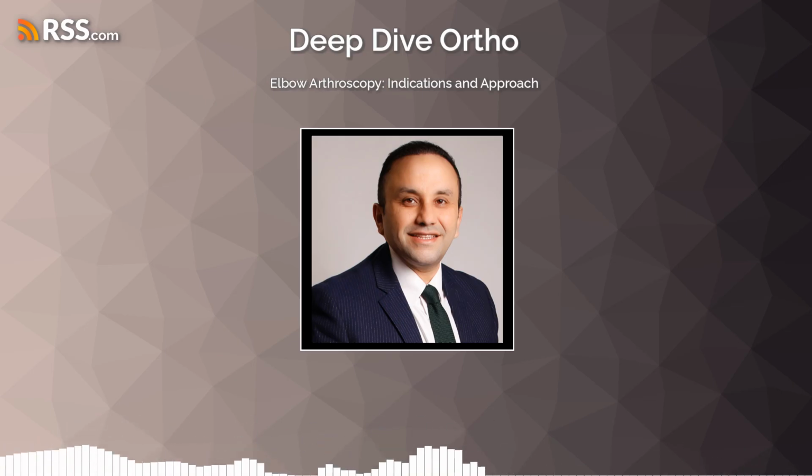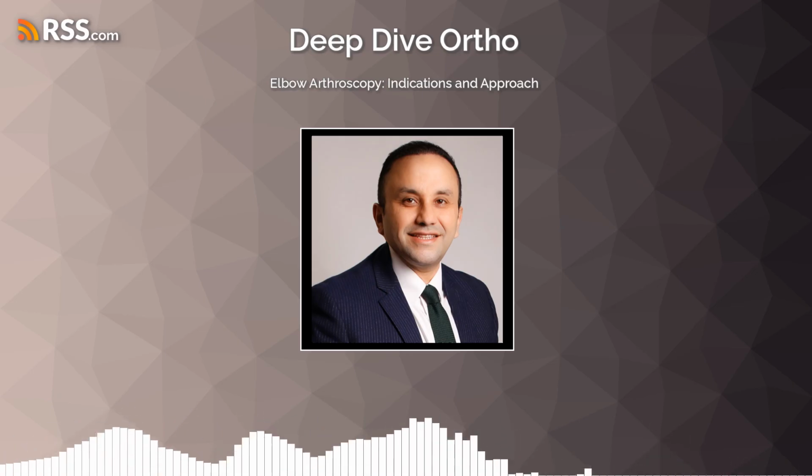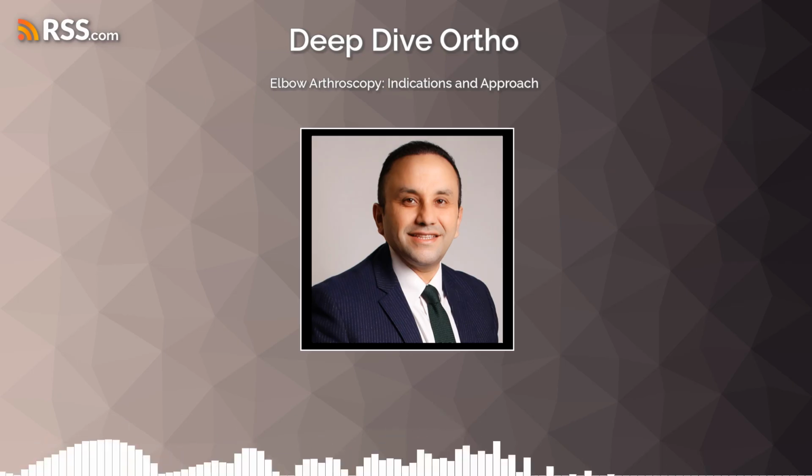The key insight here is that for PLRI, arthroscopy offers not just a diagnostic tool, but an effective, minimally invasive repair option that can restore crucial lateral elbow stability, allowing patients to regain confidence in simple, everyday movements.